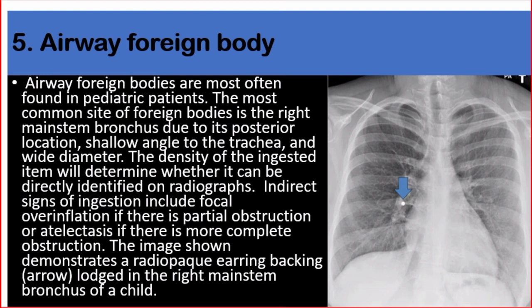Number five: airway foreign body. Airway foreign bodies are most often found in pediatric patients. The most common site is the right mainstem bronchus due to its posterior location, shallow angle to the trachea, and wide diameter. The density of the ingested item will determine whether it can be directly identified on radiographs. Indirect signs include focal overinflation if there is partial obstruction, or atelectasis if there is more complete obstruction. The image shown demonstrates a radiopaque earring backing lodged in the right mainstem bronchus of a child.